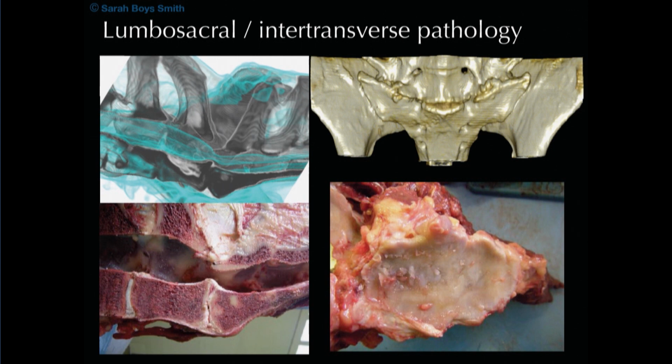So I think, as Mariana said, there's a huge amount that we are missing, and hopefully, with the advancement of better imaging equipment, such as more advanced CT and so on, in the future we will potentially be able to see these changes in the live horse, or certainly determine their significance with a bit more relevance.